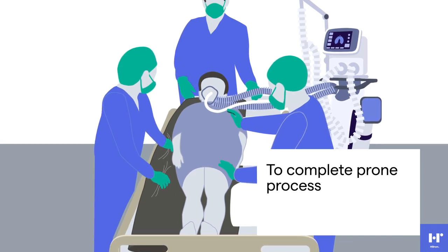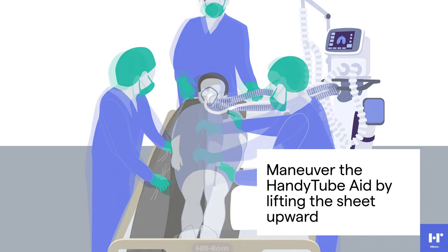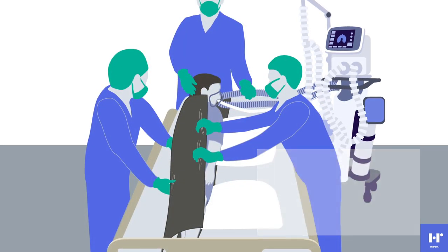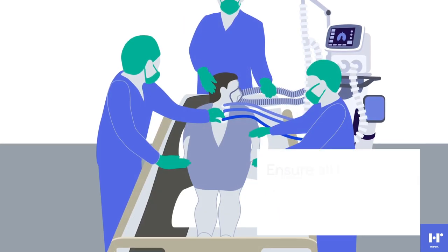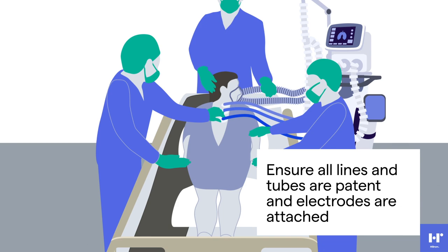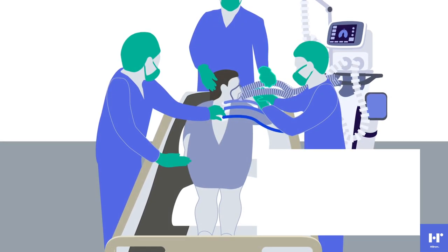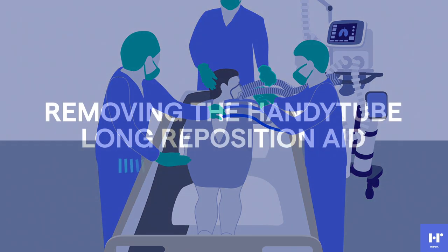When ready to complete the prone process, the care team member on the right side will maneuver the handy tube by lifting the sheet in an upward vertical motion. The patient will gently roll onto the pre-placed pillows. At this time, the care team will ensure that all lines and tubes are patent and electrodes are attached. An additional pillow or foam block may be used to support the face once the turn is complete.